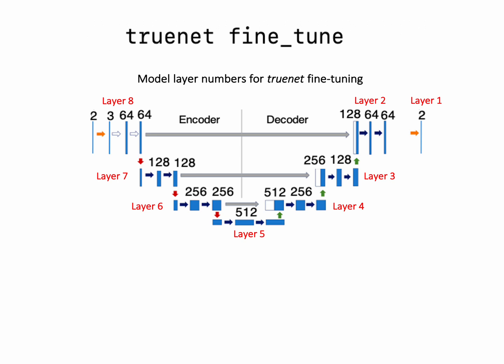Another thing I wanted to mention here is that this is not a retraining. This is called fine tuning because we want to do only a fine tweaking, which means that the learning rate that we use for fine tuning is much lower than the learning rate we use for training. If you remember, I mentioned an option called ILR, the initial learning rate, in the previous slide. So here you specify lower learning rates. You don't use higher learning rates.